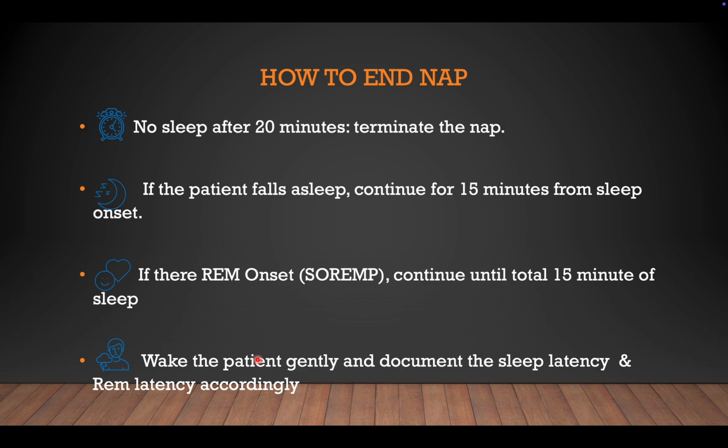Now, how to end the nap? What we are doing is, we have prepared the patient 2 weeks in advance, and then we have done an overnight PSG the night before the MSLT. The study stopped in the morning.